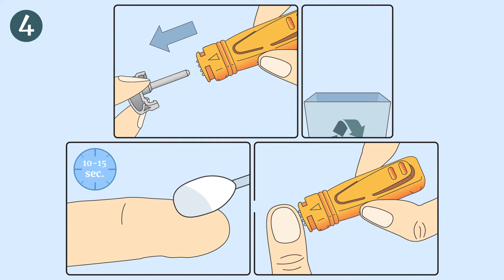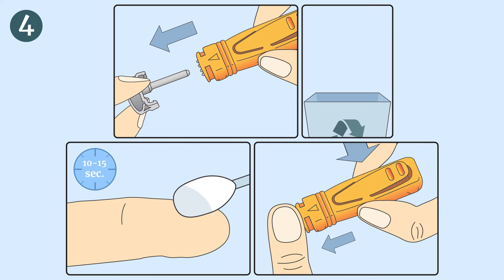Press the platform firmly against the side of the previously cleaned finger and press the release trigger button. The tip will automatically retract into the body of the device.